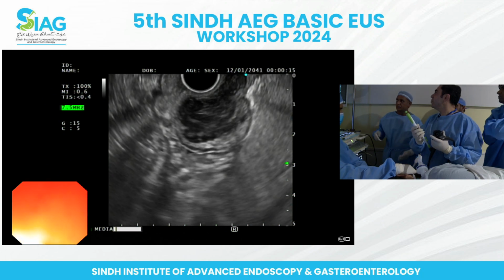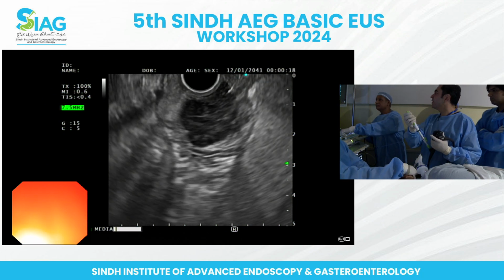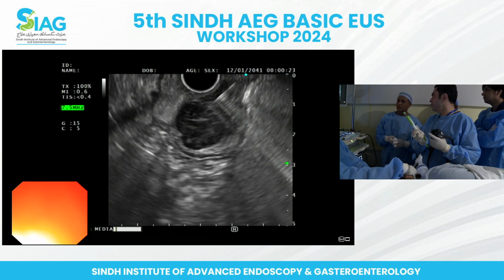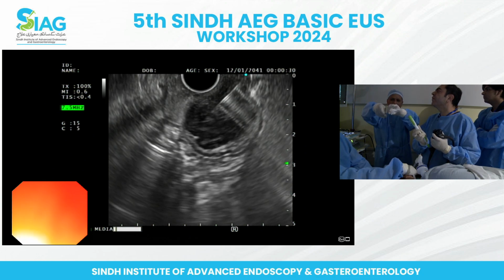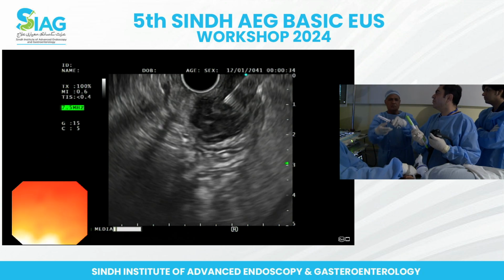So the key thing was that when I had the, okay, Doppler please. Okay, excellent. Doppler can go off, and then if you just remove the needle, we won't do a slow pull this time. We'll do proper suction. Was there a tissue there or no? Sorry? Was there a tissue? No, we didn't get any tissue. So do you want to use a suction on that? That's right. We just got the suction ready.